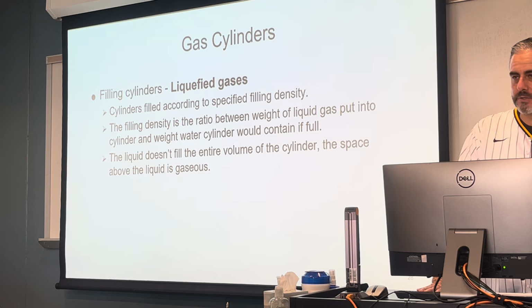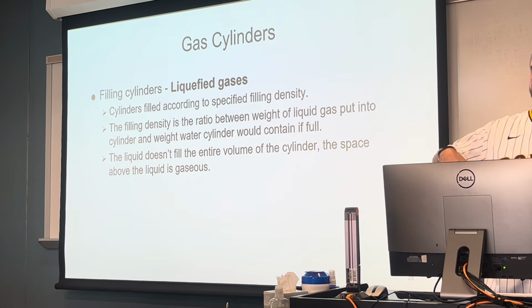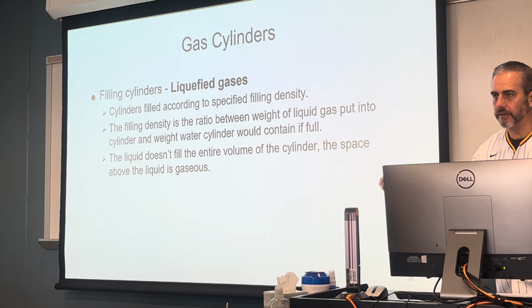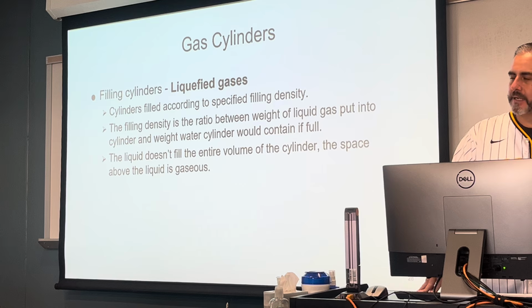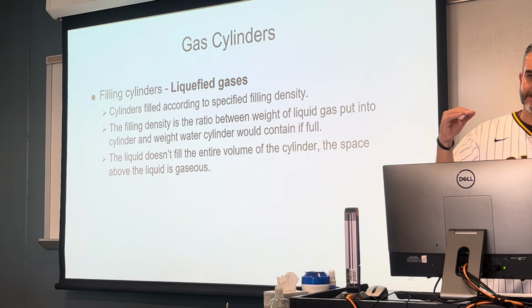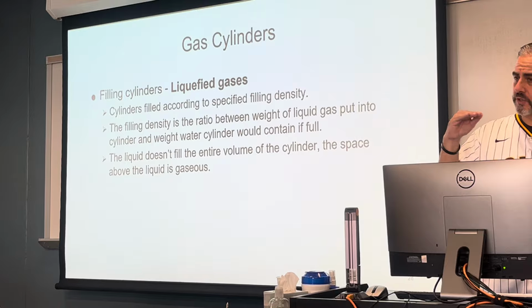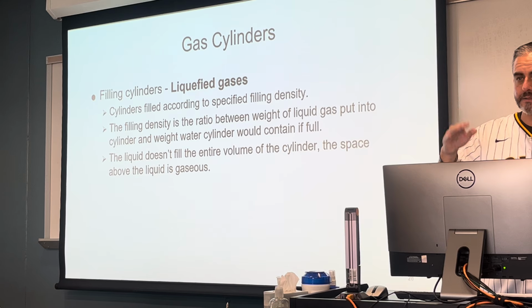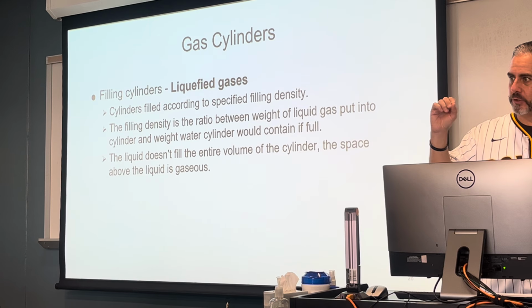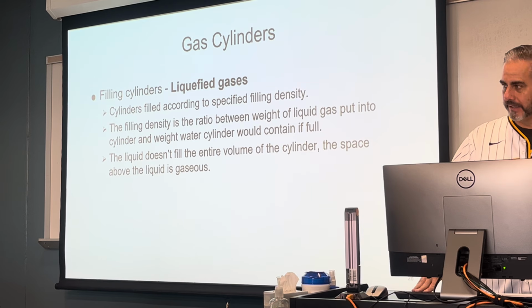Liquid cylinders are filled according to their filling density, which ultimately relates to the weight of that cylinder. So when we do have liquid oxygen, liquid gases, the entire cylinder is not necessarily filled with liquid. At some portion up toward the top, where there's no more liquid, just above that, there will be gas. Regarding filling, these are filled to a certain density, or better yet, a certain weight of that liquid gas.